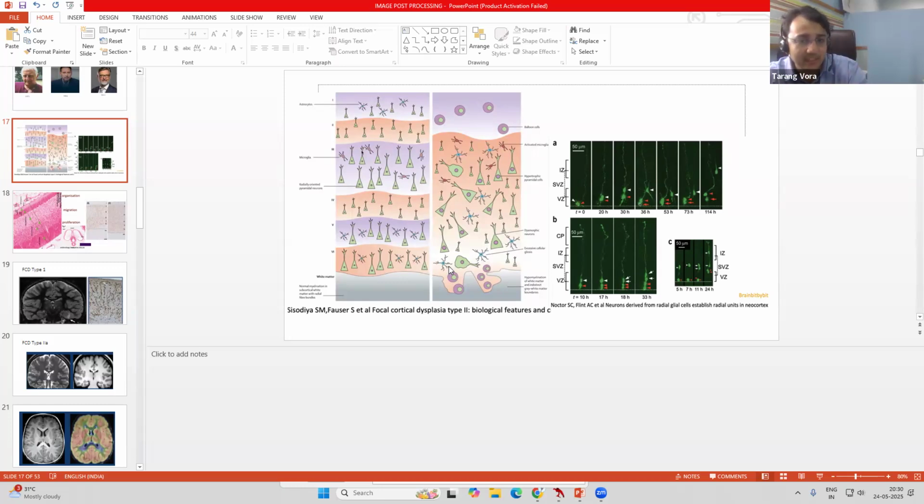But during the PET, if the patient is having a seizure, it will pick up as a hypermetabolic area, and that is why it is necessary for us to have EEG during the PET. That has been a technical challenge for us. Currently, we are not doing EEG during the PET. When we do EEG during the PET, if there is a seizure going on, then we know we have to look for hypermetabolism. But if the seizure is clearly interictal, then we are looking for hypometabolism.